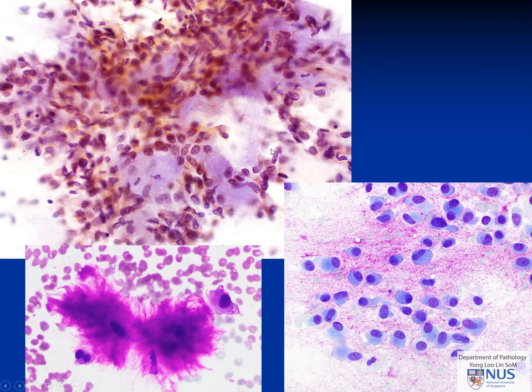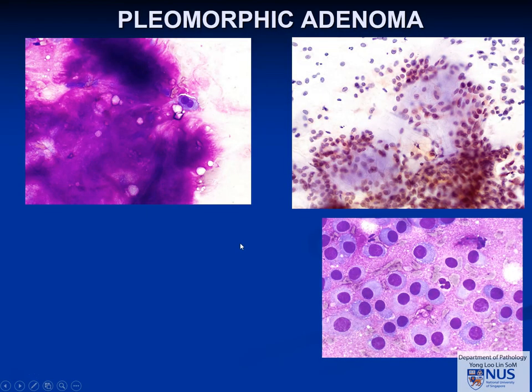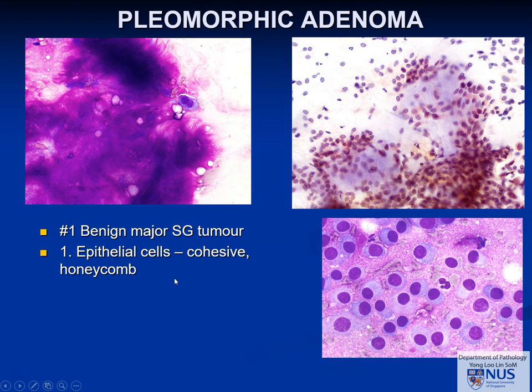So here is a cytologic picture showing you the alcohol-fixed smear. What we see is epithelial cells blending into this stroma, which is very pale and grayish on the pap-stained smear. The stroma appears very characteristically metachromatic, with a bright purplish appearance and a fibrillary texture on the air-dried smears. And in the background, we often see singly occurring cells with intact cytoplasm, many of which may have a plasmacytoid appearance. So here are the features. This is pleomorphic adenoma, which is the commonest benign major salivary gland tumor.